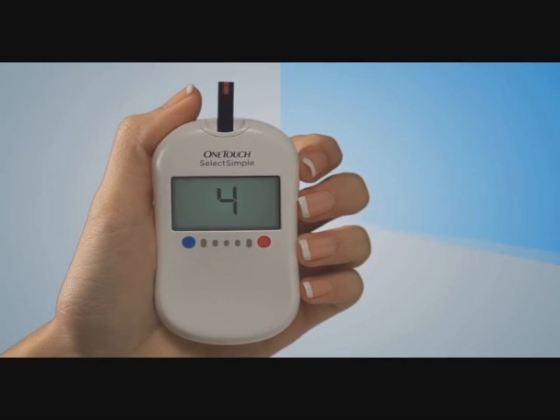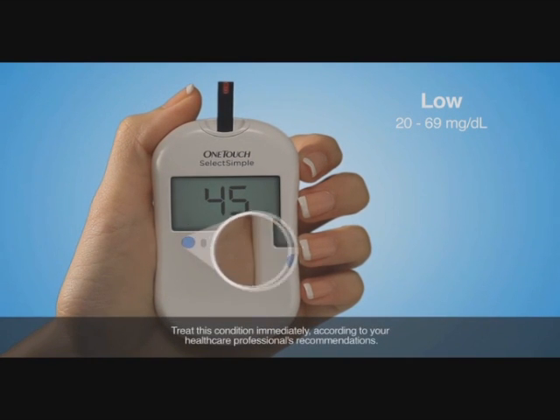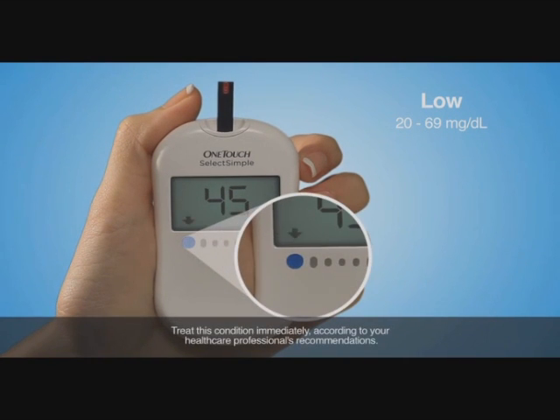After just five seconds, your blood glucose level will appear on the screen. If your blood glucose level is 69 milligrams per deciliter and below, you'll see a flashing arrow point to the blue dot and hear an alert.